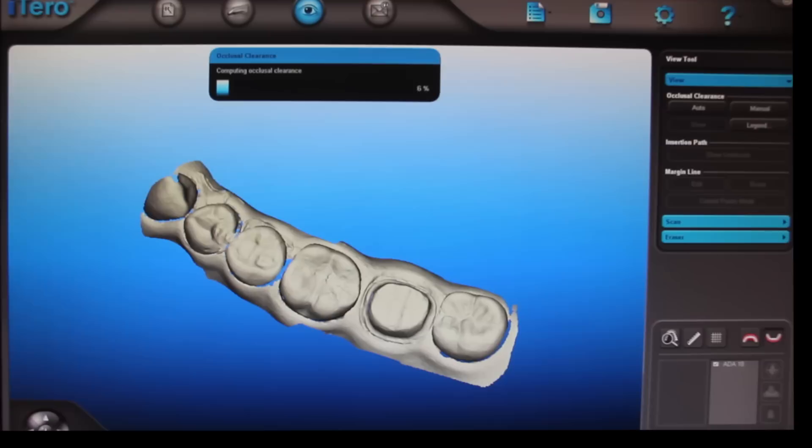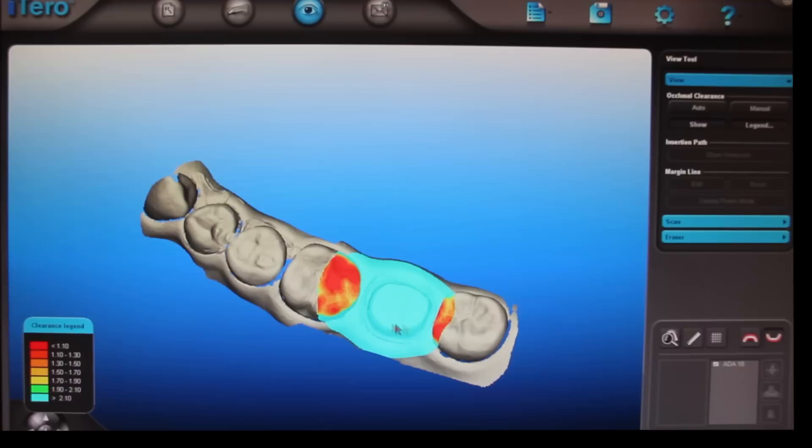So now you're looking at an image on the screen that shows the blue area right here, shows the most highlighted and most important areas. Where you see the red, it means the teeth are touching or nearly touching. If you would see that red over the prep, or even yellow, you know you don't have enough reduction. And you can go back and change that, reduce it down, and then re-scan that particular area. So we'll get rid of that.